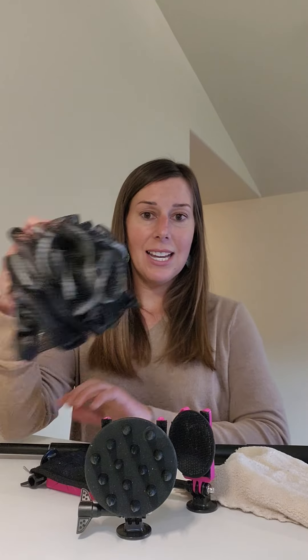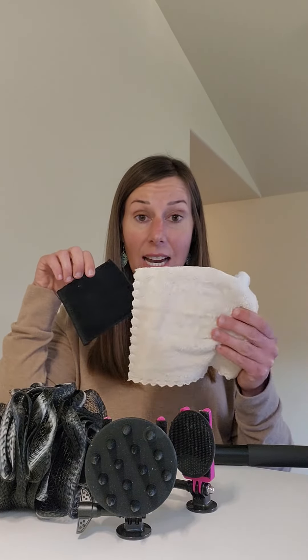Joe has created a variety of different bath attachments that will go on the Soach Stick. He has a loofah, some different pads and towels, and different scrubbers.